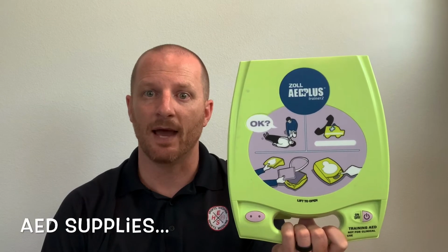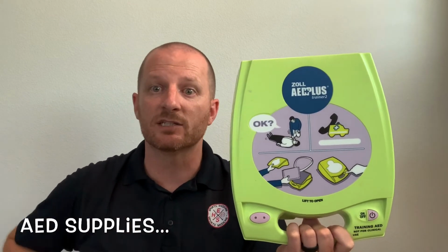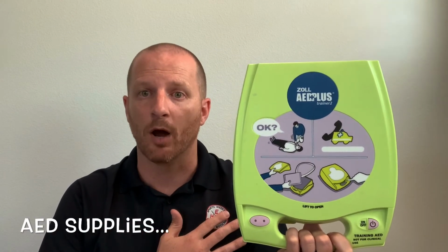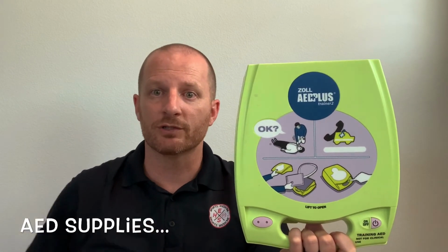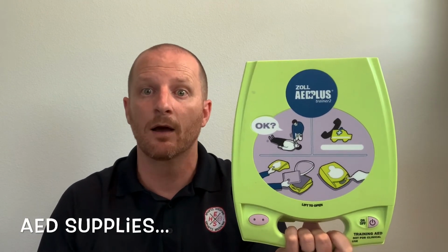The second thing in the bag is a rag. We can use the rag to wipe down any sweaty area or water that might be on them so that the pads can stick properly. The third thing is a razor. If somebody had a very hairy chest, we can shave the portions where the pads would go, so that way again the pads can stick properly.